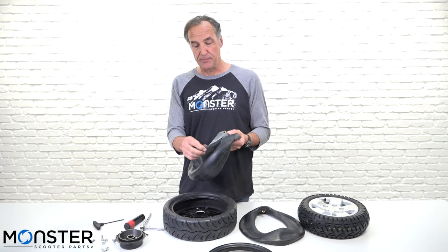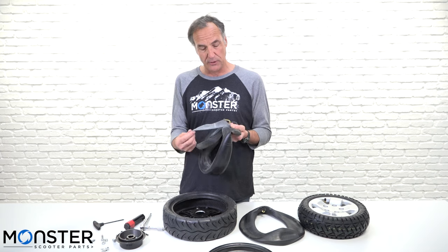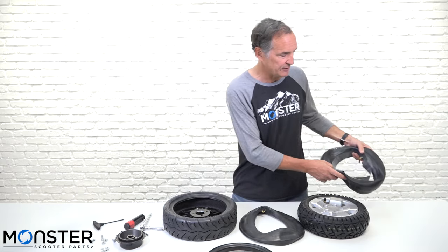As you can see, the old tube had a rim strip installed on it. That's just because it's the factory tube. They don't really need these rim strips — they're only usually used on bicycles with spokes. New tubes will not have those.